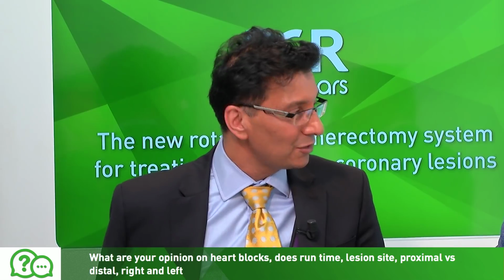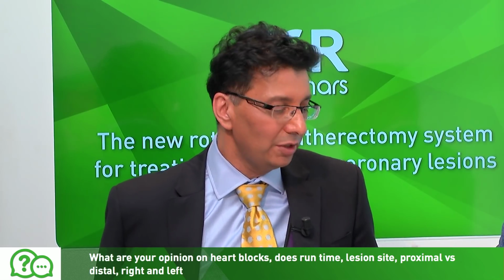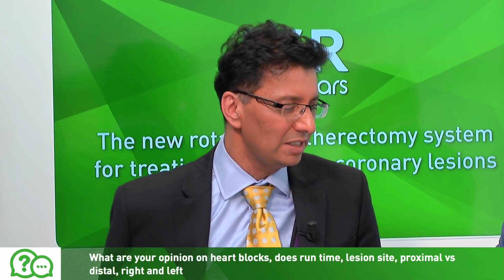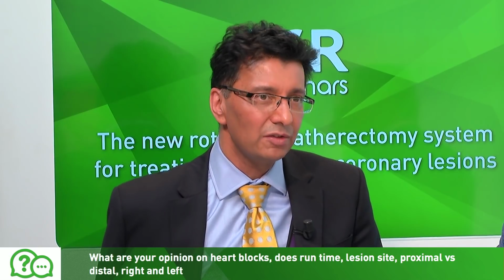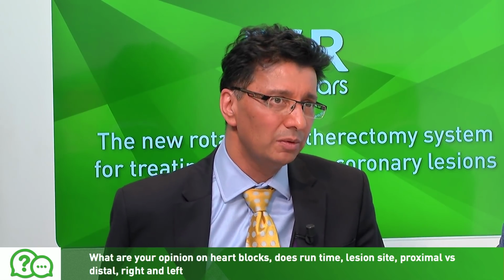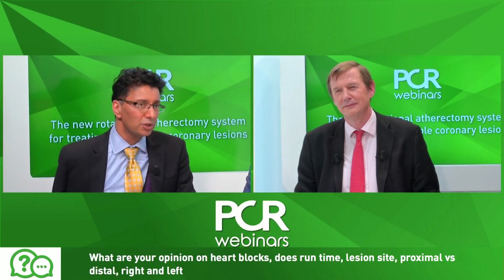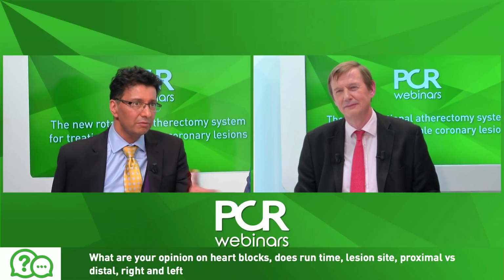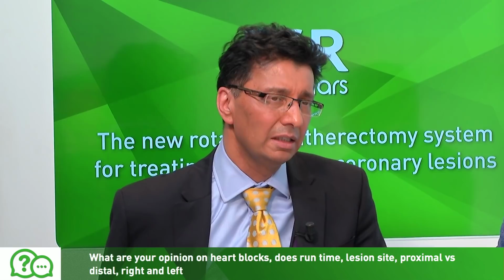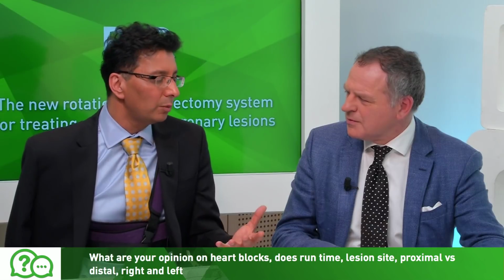I would agree, from our discussions earlier, that it is quite a random thing. There'll be lesions where you think, well, I'm definitely going to pace here, and no pacing is necessary, and other times when it's a relatively short lesion and they require it. So it is, to a degree, unpredictable, but because it is usually short-lived, you can just stop burring and give time for it to recover. No one ever leaves the lab requiring pacing, and I think that has therefore reduced the need for a pacemaker. But I will always have it ready.